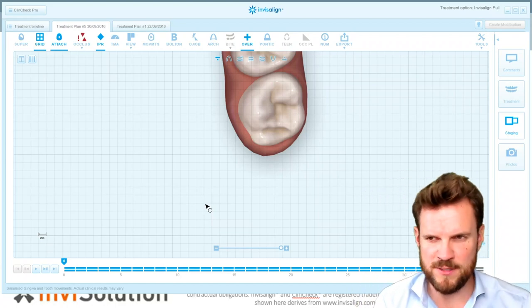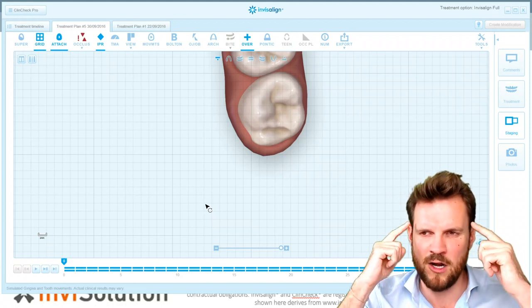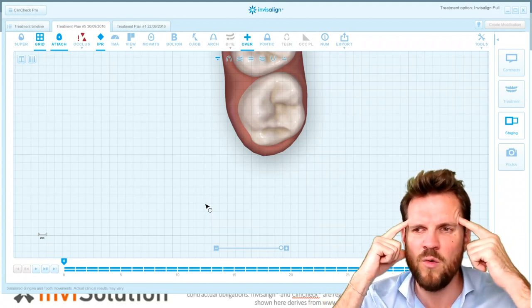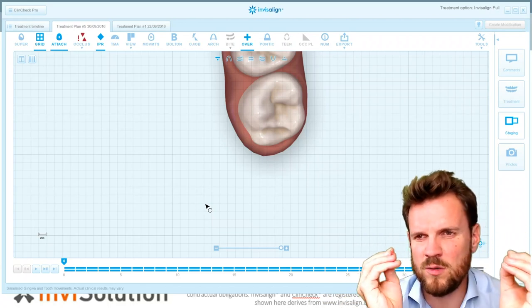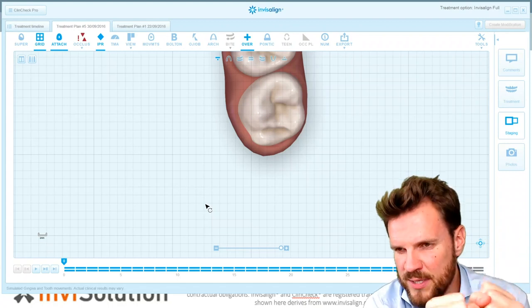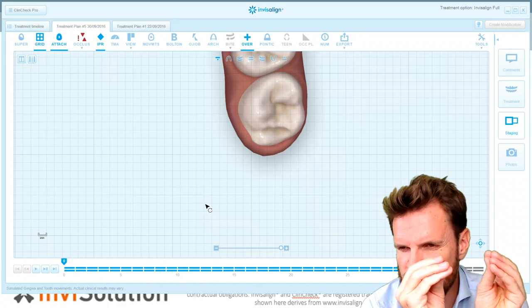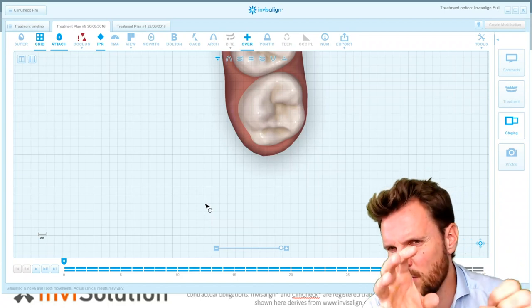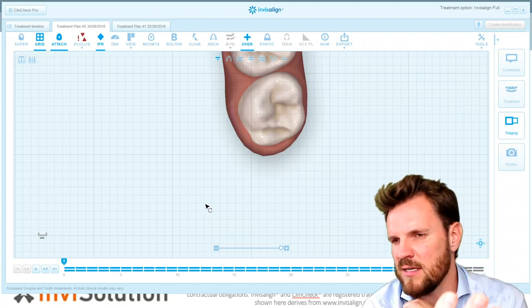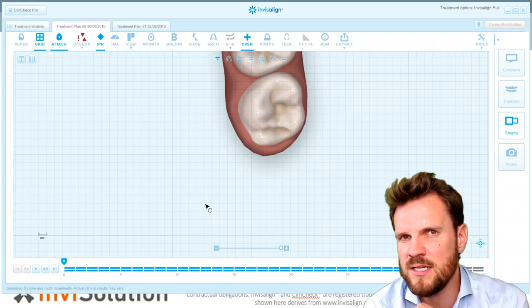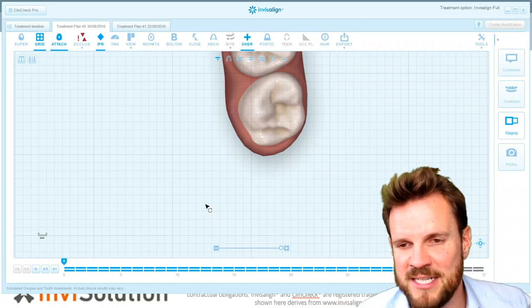I showed you three different types of clean checks, just to show you that there are always the algorithms of the software, but it also needs your priorities to make the clean check more predictable for your patient. It's very easy to do — you just need to focus on treatment planning and on what happens exactly in the clean check, and then decide: can I make it easier? Can I make it more predictable? And yes — how can I make it more predictable?